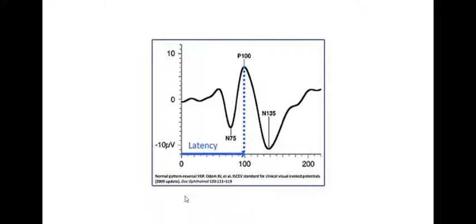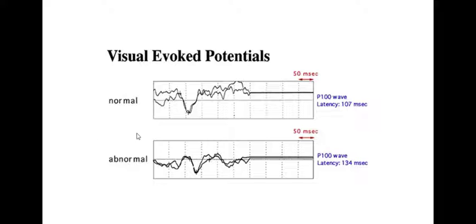Reading the obtained graph, this measured time refers to latency. Comparing the graphs of the normal and abnormal visions, we observe that the latency is higher in the second case. This indicates that it takes more time for the electrical signals to reach the visual cortex. In fact, this can be caused, for example, by issues affecting the myelin sheath of the optic nerve.